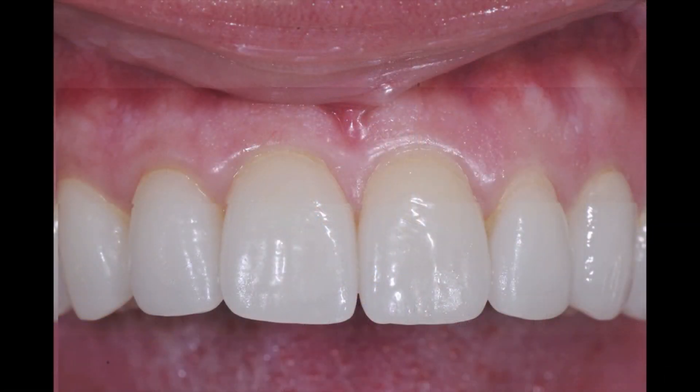Today we're going to show you a veneer case. Our patient, Lynn, is excited about a smile change. She's had composite veneers on teeth number seven through 10, and we're going to change those. We're also going to show you how to do intraoral scanning with the PlanScan, a blue laser technology, and then design these veneers. We'll show you how to plan the case, prepare the case, and eventually seat the case and give Lynn a wow smile.